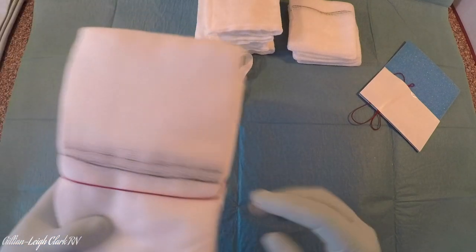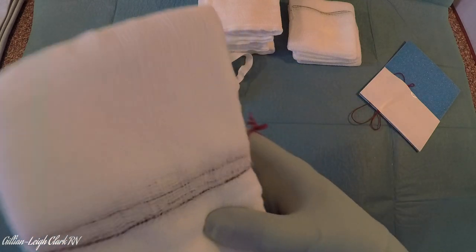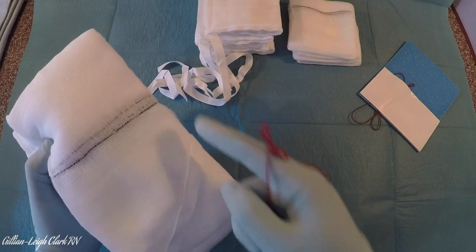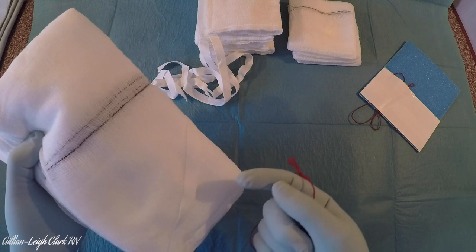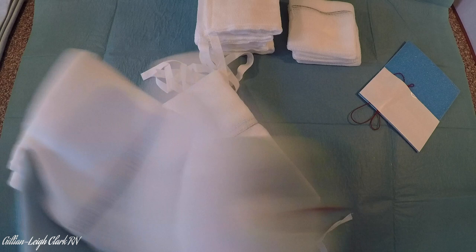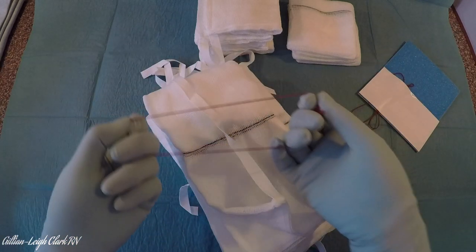Muslin packs are a bit more unwieldy — they're awfully large, which makes it a bit more tricky. Red tag — off it comes. I tend to swap hands; whichever you prefer, it doesn't matter as long as you do it safely. You're checking your tape is secure, that you have an x-ray strip, and that it is only 5. If you were to have a packet of 4 or 6, they must be discarded, bagged and tagged, and kept away from the operating field — you would start again. Muslin packs: 1, 2, 3, 4, 5. Red tag goes away.